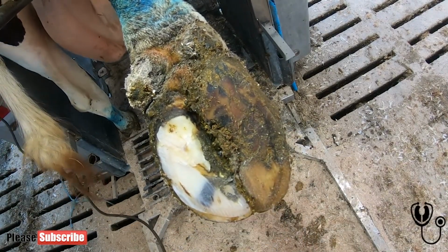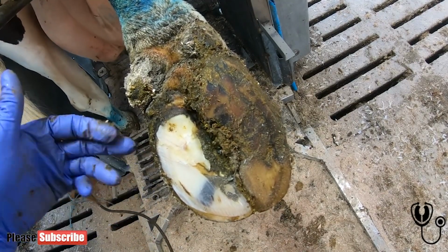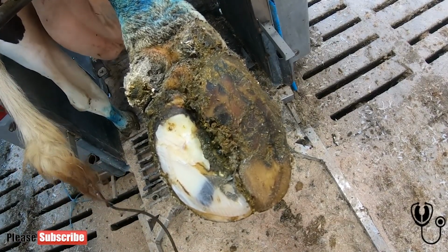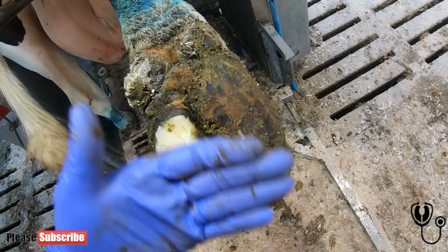Block's removed, and part of the reason to remove the block as well is she's obviously had it on quite a few weeks, so we need to make sure that this claw isn't now starting to have problems because it's bearing too much weight. So we're going to go ahead and take back the loose horn here and see what's happening.